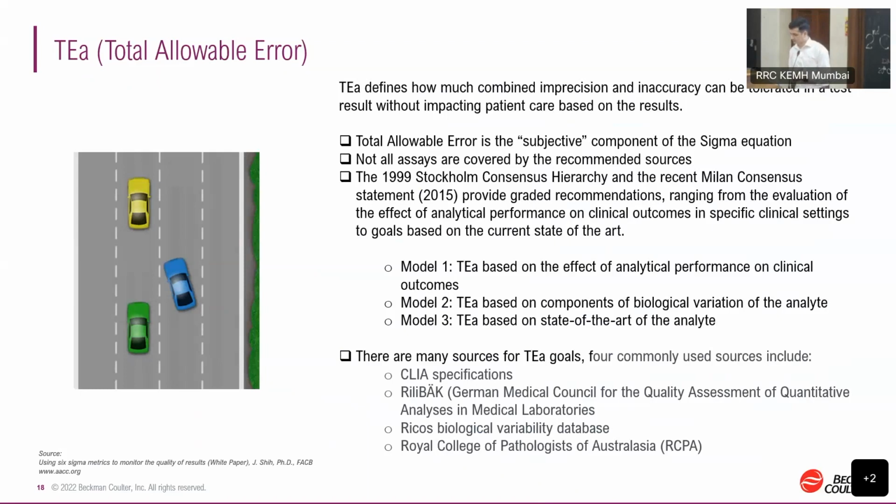The allowable error is a subjective component for the sigma equation. Whatever sources you see, not all parameters can be covered for TEA.